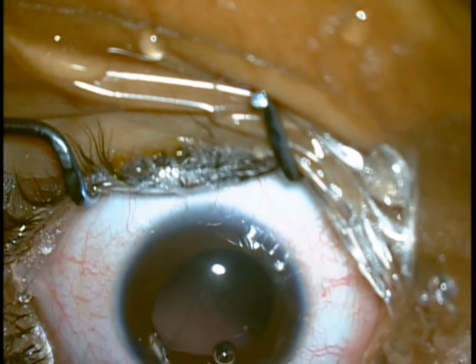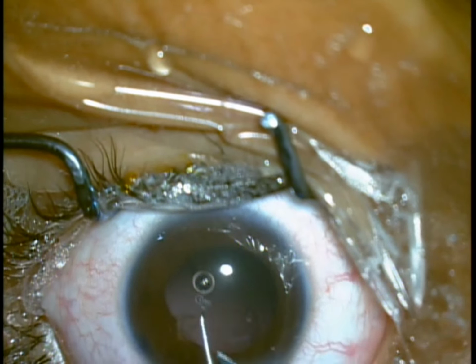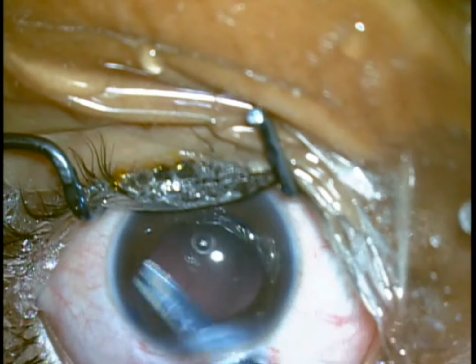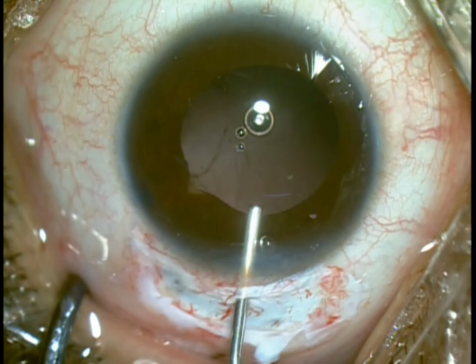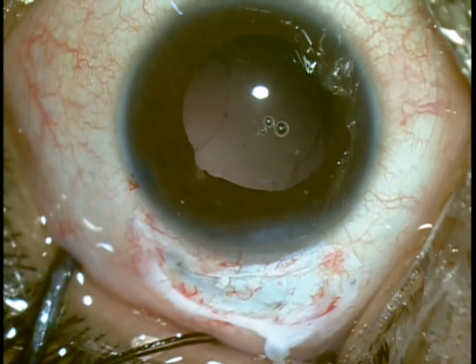The remaining part of the cyst, which lies hidden behind the iris, is separated from the surface of the iris and all the adhesions removed. Its extent is inspected so that it can be removed in toto.